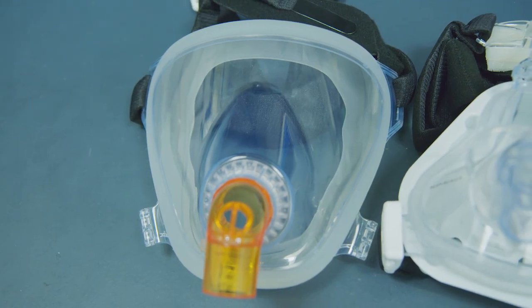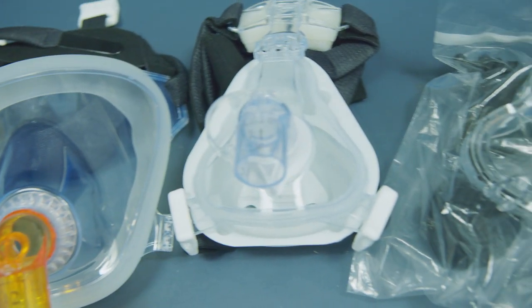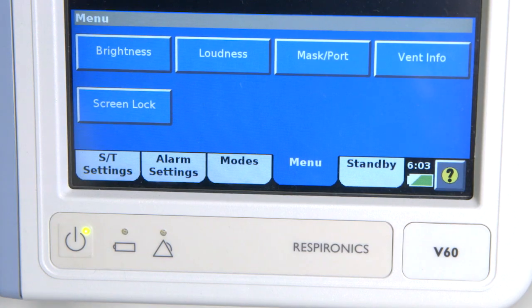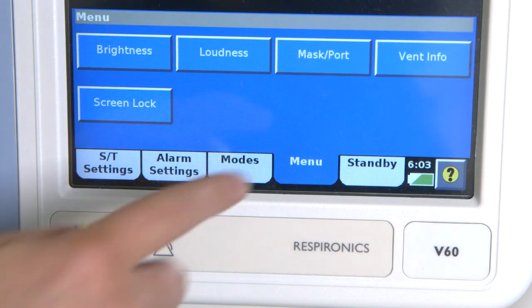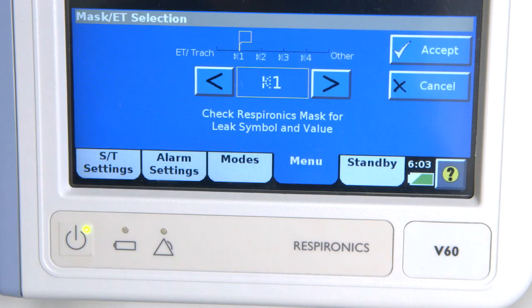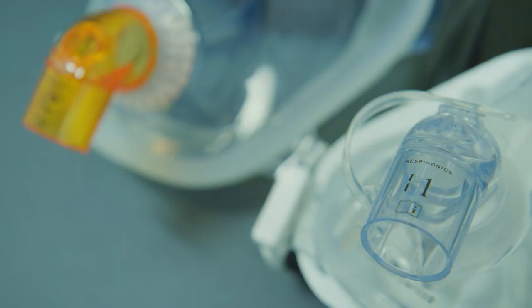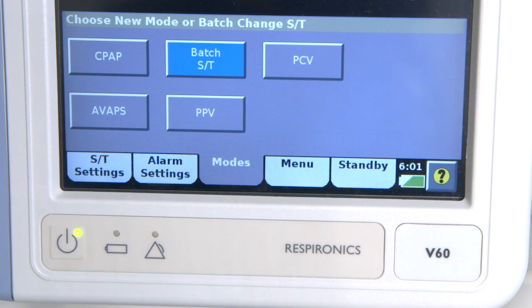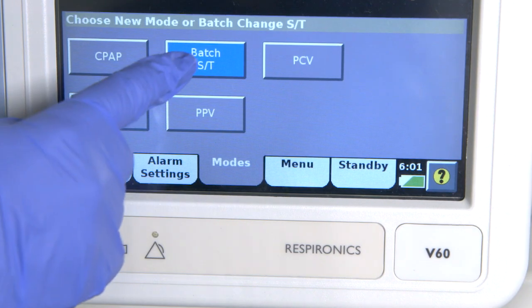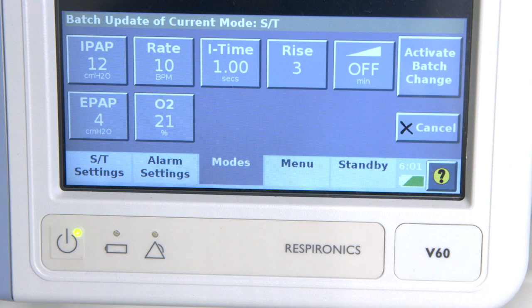Once the circuit is connected, it is important to select the correct size mask for the patient. Switch on the machine and select the appropriate interface in the mask port section under menu — this should correlate with the expiratory port number on the selected mask. In the mode section, select ST, which means spontaneous with timed backup, meaning the patient is breathing spontaneously but if they go apnoeic the machine will provide them with breaths.